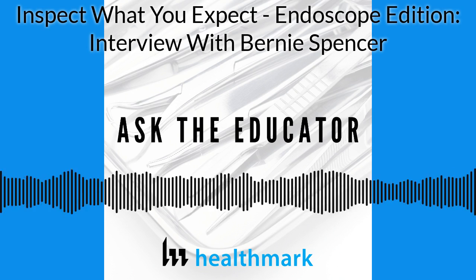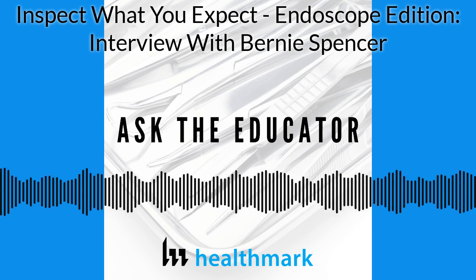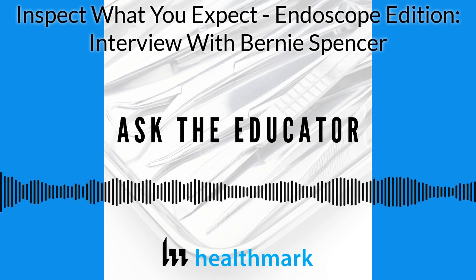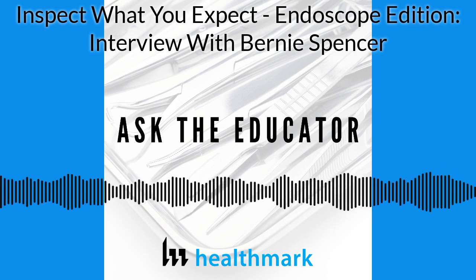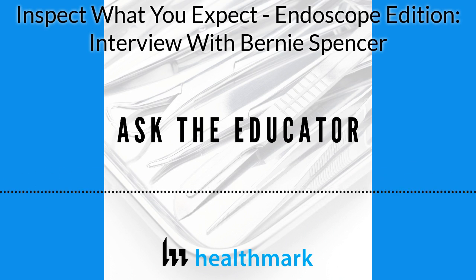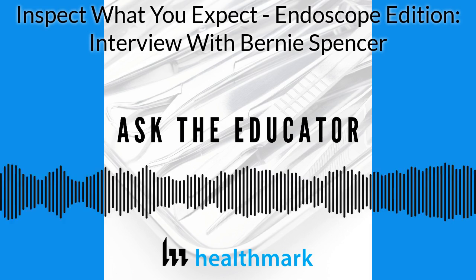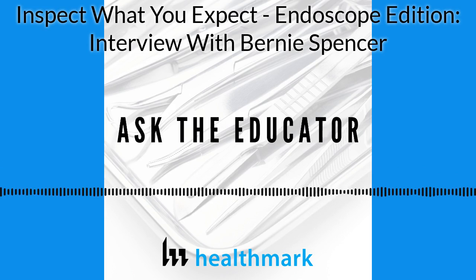Perfect. Yeah. So how does my conversation so far apply to the medical field? I'll give you a very specific example, manually cleaning the instrument channel within a colonoscope or EGD. The manufacturer's instruction for reprocessing instructs to insert the brush into the suction valve port and down through the channel and out the distal end of the insertion tube. Then the brush is to be cleaned with gloved fingertips. Next, pull the brush back through and out of the channel. And at this point, the brush is visually inspected. And if there are any debris or discoloration present, we need to clean the brush and repeat the steps until there are no debris or discoloration present.